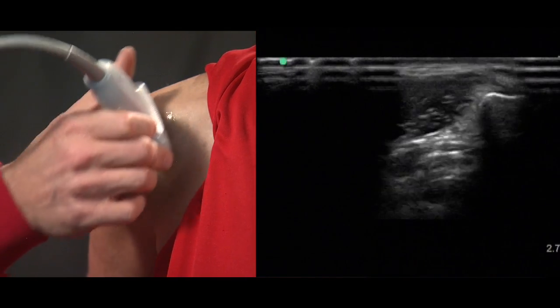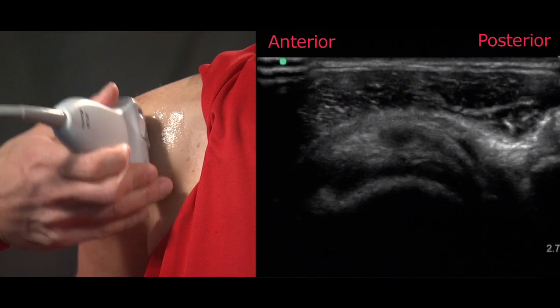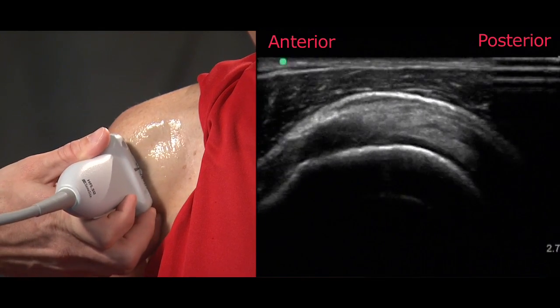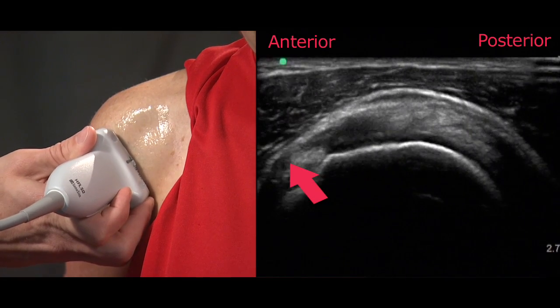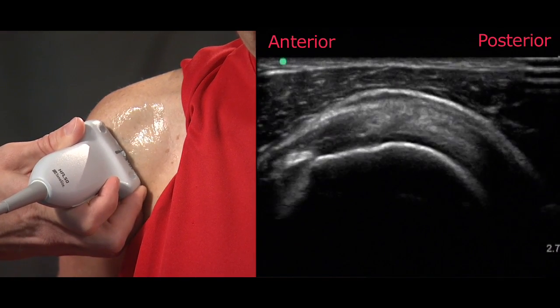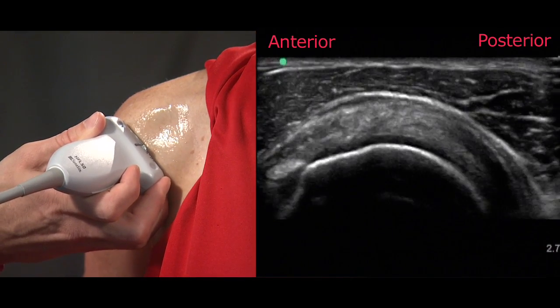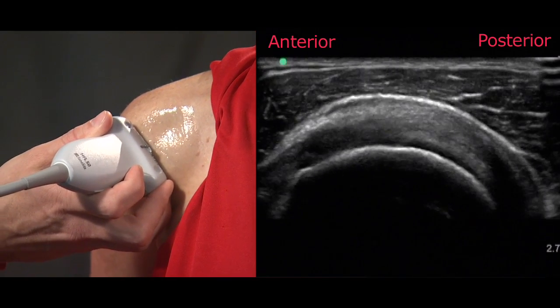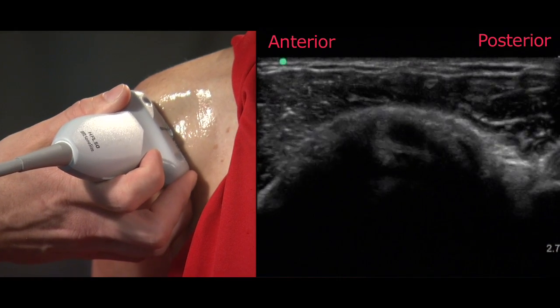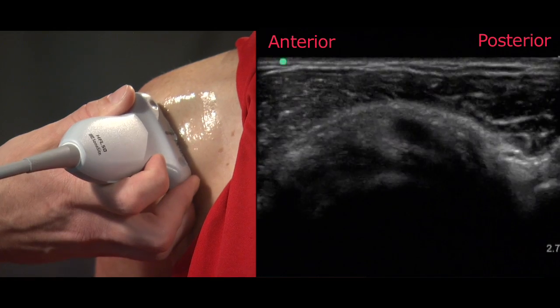As with all structures, we want to get an appreciation for the three-dimensional characteristics of the tendon, so our next image is a short axis examination of the supraspinatus tendon by orienting the probe 90 degrees from our previous examination position. It's best to try and capture the biceps tendon within this image so that you can surely assess the anterior border of the supraspinatus, as this region is often incorporated in what we think are some anterior border tears. By sliding up the length of the tendon we assess and look for any type of defect, and as you can see on the left side of the screen we are able to visualize the biceps tendon.